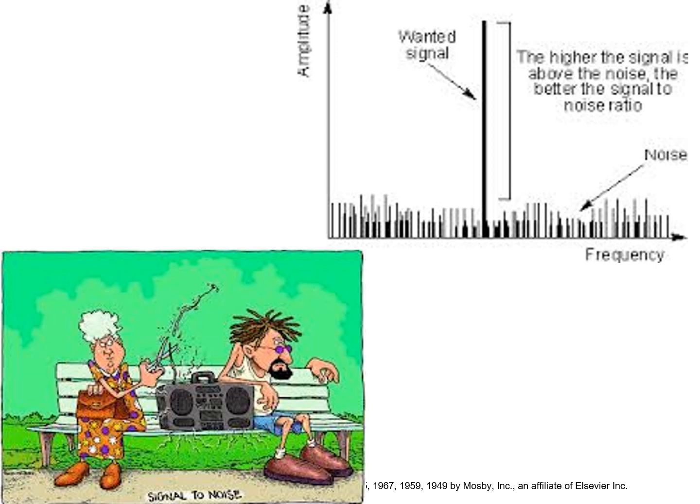See, your radio is actually catching a wave being broadcast from a radio tower in Nashville. So that top right-hand picture, that's like the useful X-ray beam or the radio signal that you're trying to tune into, okay? So when that is very, very amplified relative to the noise, the software can say, oh, this is actually what we're looking for. All this other stuff is just garbage. We can ignore it. Okay?